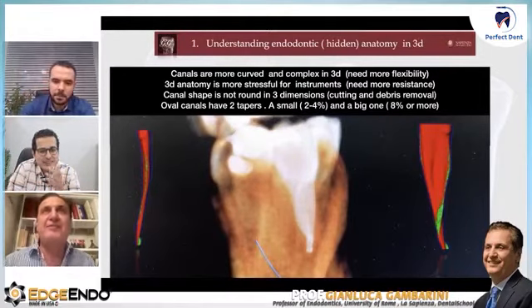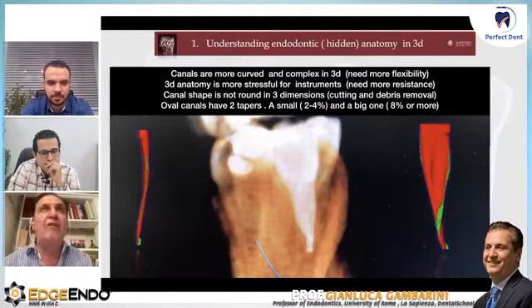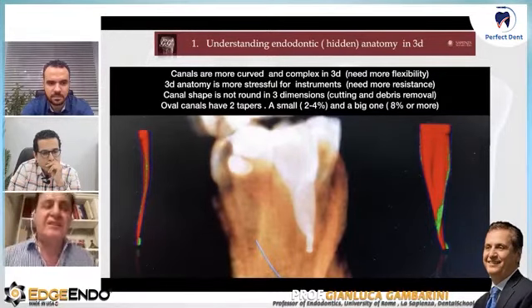So that's a very important thing we have to understand. And last but not least, the majority of root canals are oval. They're not round. Now, this is an interesting point because all the speakers we always hear are proposing a technique or proposing something new. Let's do this, let's do that. Actually, they never thought in 3D. They always thought in 2 dimensions.